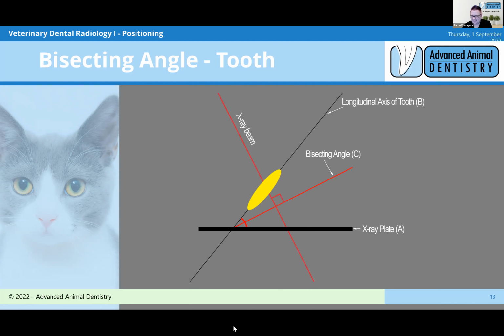Brachycephalics are just another lecture. We've got some images coming up, and there's a thing coming up we'll talk about. Karen just asked if we could talk about brachys specifically and positioning techniques for them. So when we talk about some x-rays that we've got coming up, we'll talk about brachys in combination.